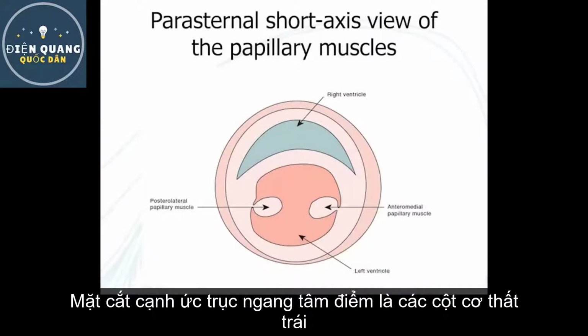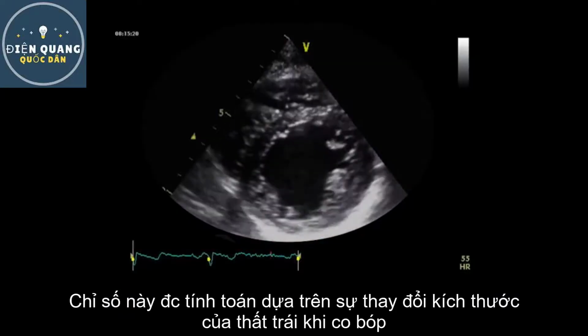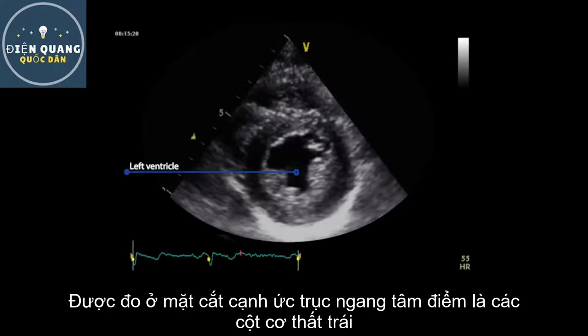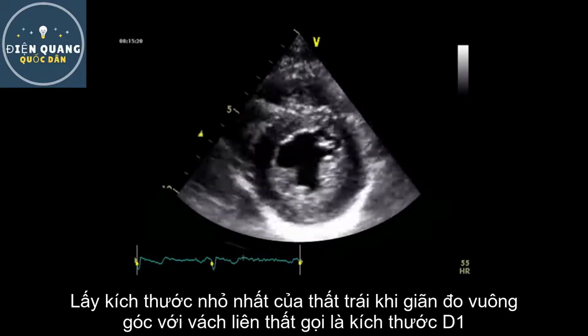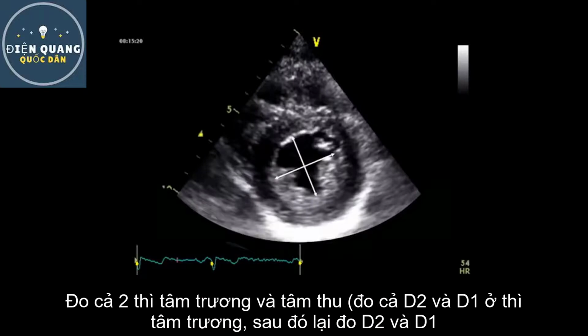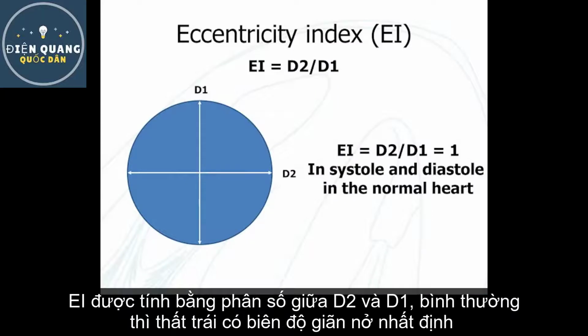The short-axis view at the level of the left ventricular papillary muscles can be used to assess the eccentricity of the left ventricle. The eccentricity index is a measure of the degree of distortion of the left ventricle, and it can be calculated from the short-axis view at the level of the left ventricular papillary muscles. It is calculated by measuring the minor axis of the left ventricle parallel to the septum, D2, and the minor axis of the left ventricle perpendicular to the septum, D1, as indicated on this video in both systole and diastole. The eccentricity index is calculated by dividing D2 by D1.